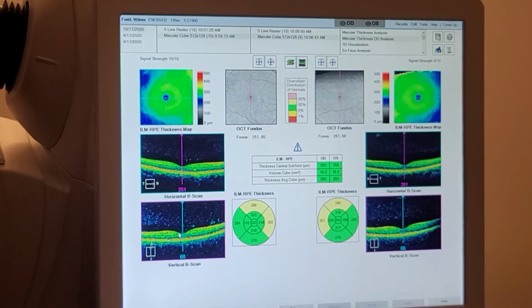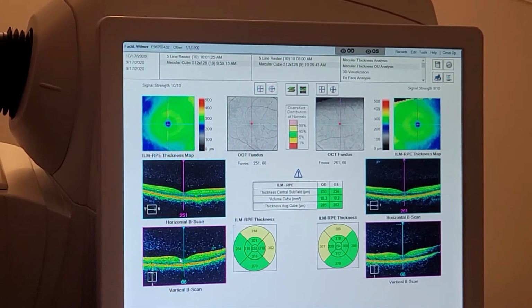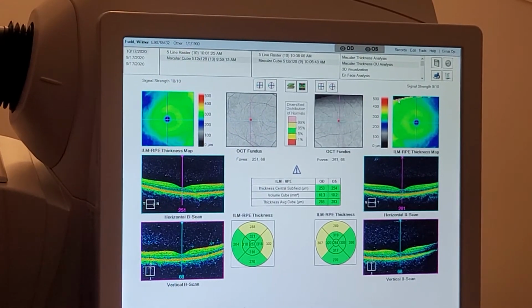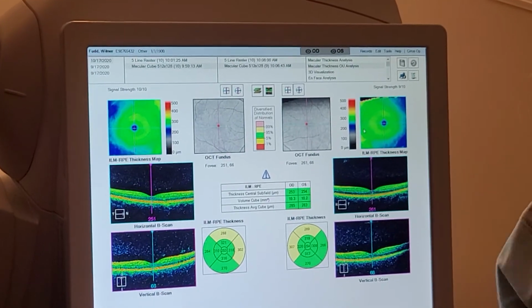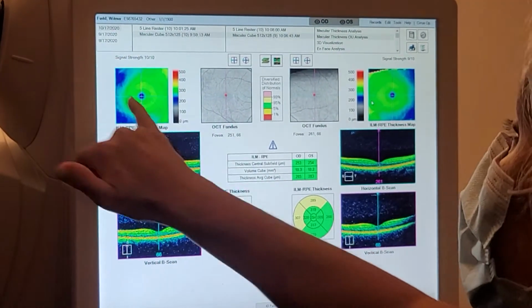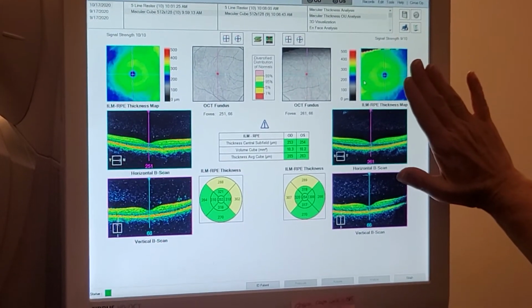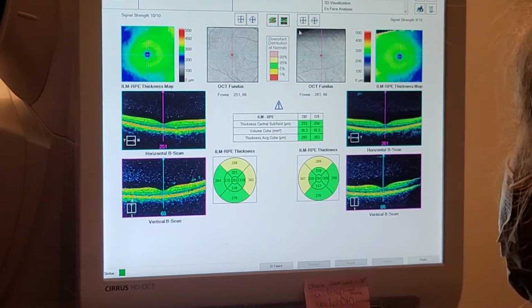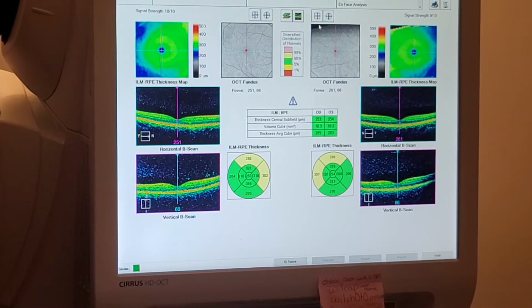Green is wonderful. You know that our colors are there to show us. If it was red, okay. So see this right up here, this part right here where it's black? Now, I could have really gotten a better photo. I should be able to get that for you on this one. It's okay there. However, see how it missed it right here? That's his eyelid. It's the thick eyelids in the picture.